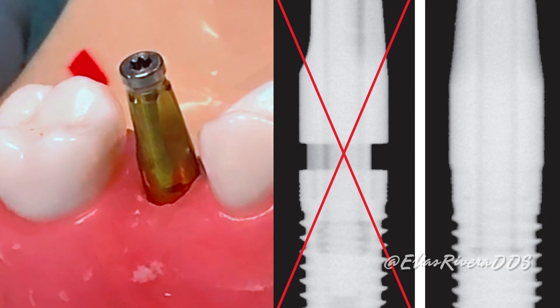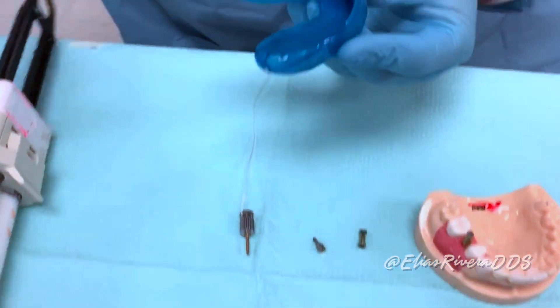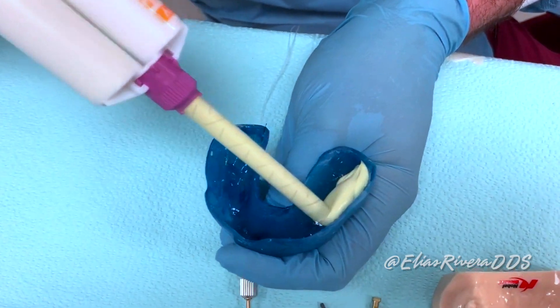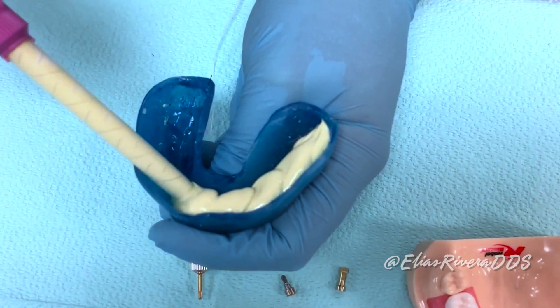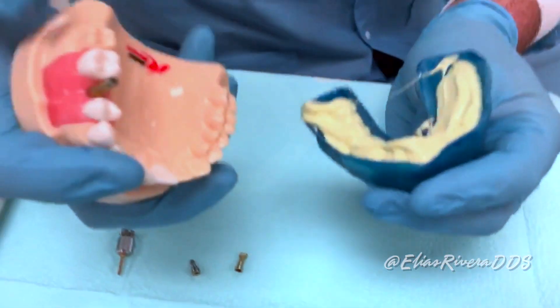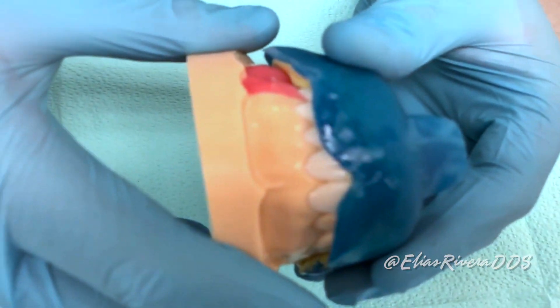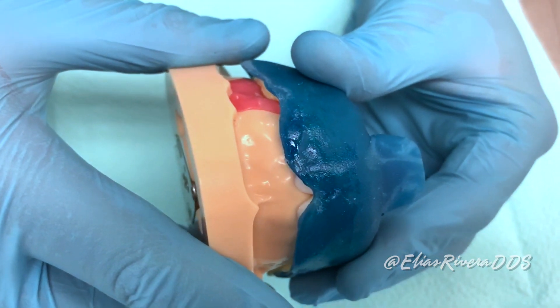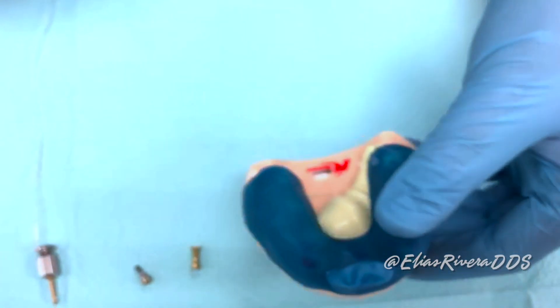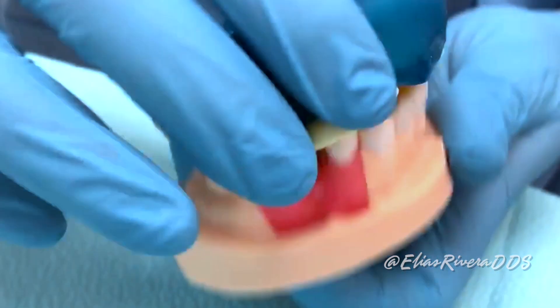Step number three: inject heavy body impression material — in this case PVS — around the impression coping and into the tray. Seat the impression tray on our simulated patient. Once the impression material is fully set, remove the tray.